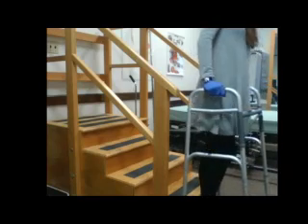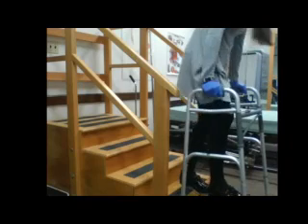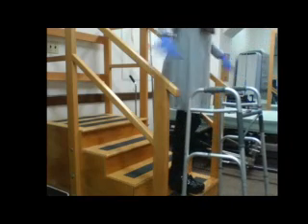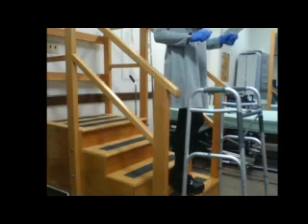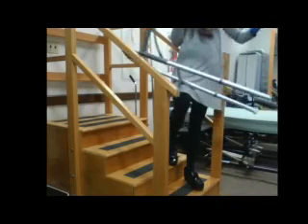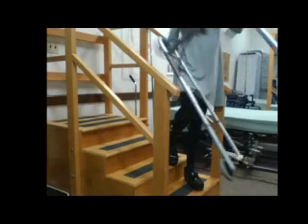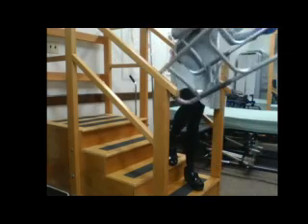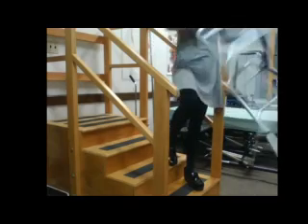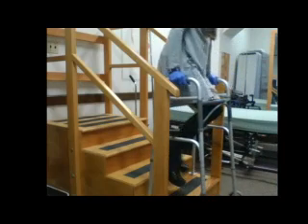One of the ways we can do the stairs is to back up to the stairs with the walker normal, have the patient raise up onto the stairs. Now, at this point, the person would need to hold on and either have a separate walker or have somebody else in their house change the configuration of the walker, because they wouldn't be able to put their foot down. And essentially what you would do is put the front legs all the way as long as they can and the back legs as short as they can. And now you have a walker that you can use on the stairs if you're going up backwards.